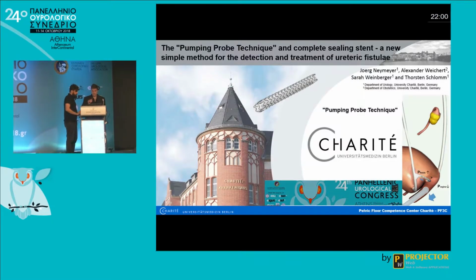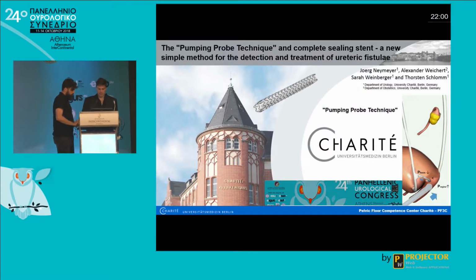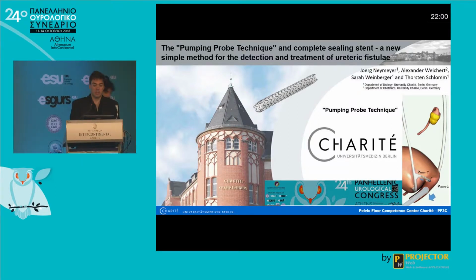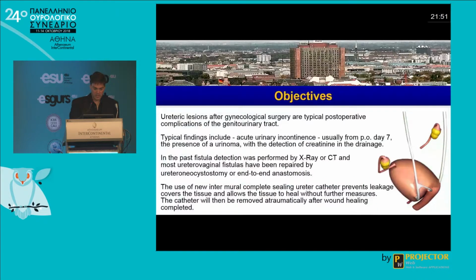Good morning. Thanks that I can be here and show our new techniques for viewing the ureter and how you can find the fistula, the ureteric fistula, really fast.